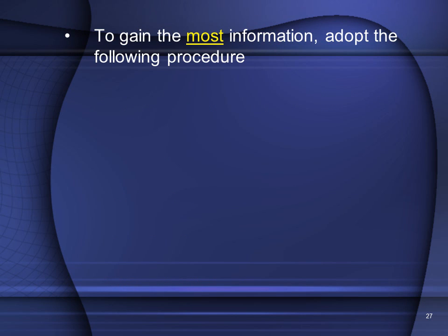So how do you gain the most information from any radiograph? My suggestion to you is that you adopt the following procedure. Number 1, always check the name and the date on the film. It's important that you never forget the patient. You need to know who you are reporting on, and you need to know the date, because a patient's condition and therefore their radiographic status may change over time.